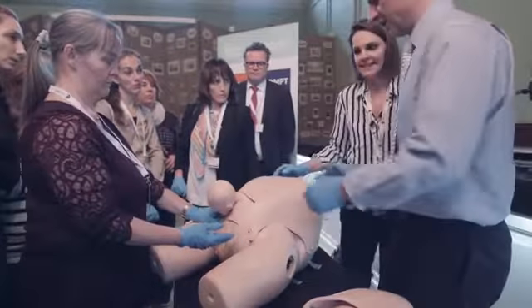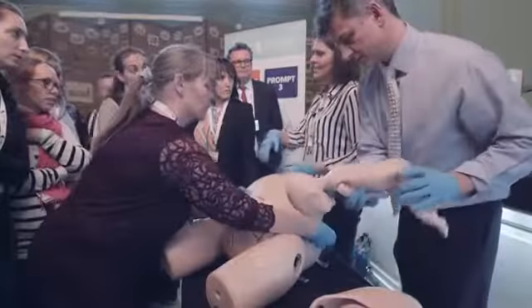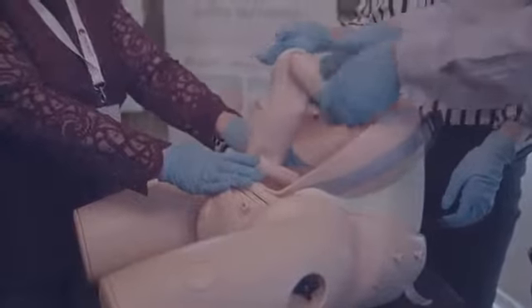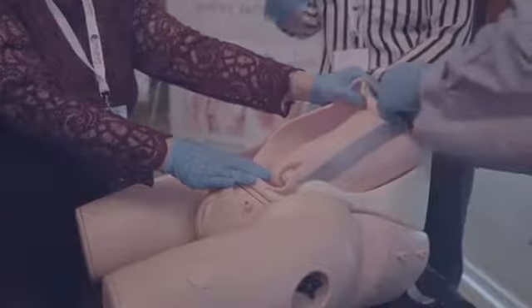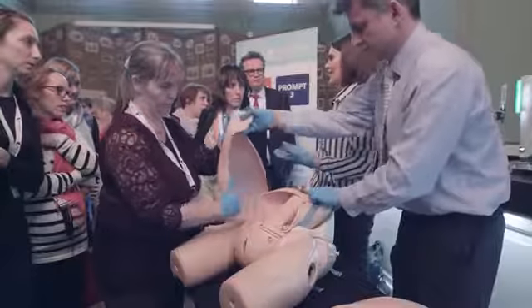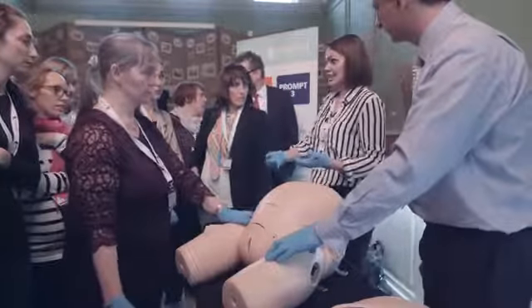Do you mind putting it in again? Absolutely. Nick, so we can do reverse breech? So it's a good opportunity for obstetricians to learn the technique, but also for multi-professional training, because a lot of the time it might be a midwife, say in theatre, who's asked to do a push-up from below, who's never done it before, doesn't know the position of the baby, doesn't know how to do it, and is feeling a bit intimidated in a high-pressure situation to say, I don't know what to do. And so may just put one finger in, put two fingers in, and push up. And that's where we're going to increase our risk of skull fractures. So it's actually really good to do as a multi-professional training exercise with the midwives as well, and then they can learn about exactly what to do.